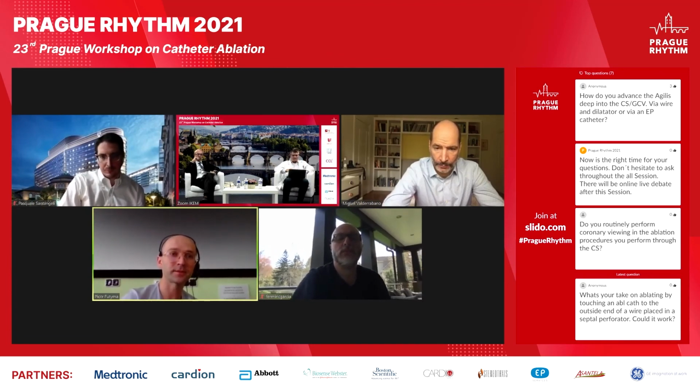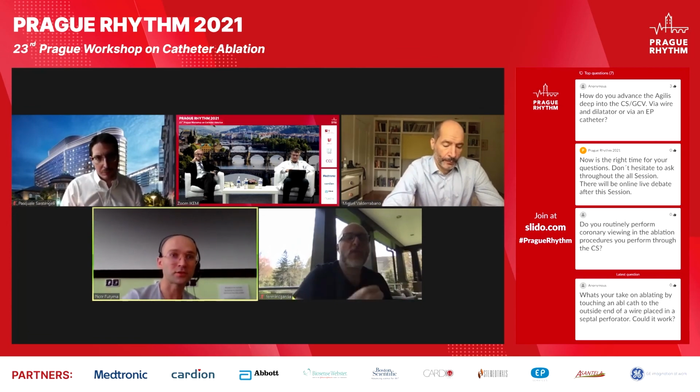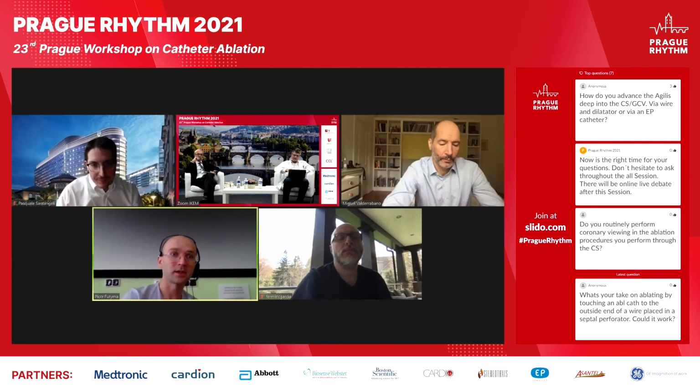The other option, perhaps this can be a surprise, is that we have quite a large number of patients treated who had their ectopy close to the bundle of His. And of course, you need to titrate your energy very carefully and track any junctional activity there. But it can be done. It's not an atom bomb you drop on the intraventricular septum close to His. I think it can be pretty well controlled. So this is also an option for the septal substrate without the mandatory AV block.